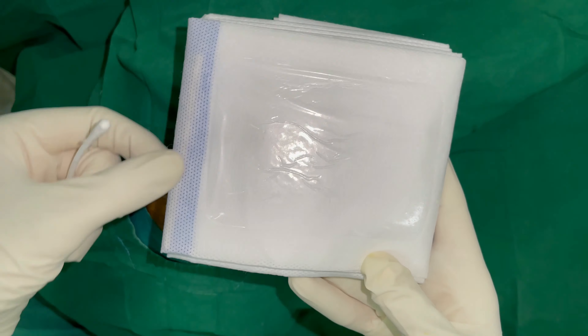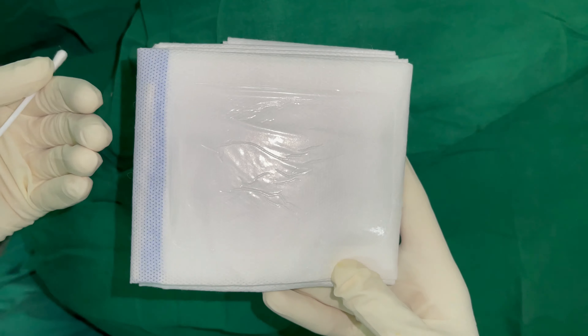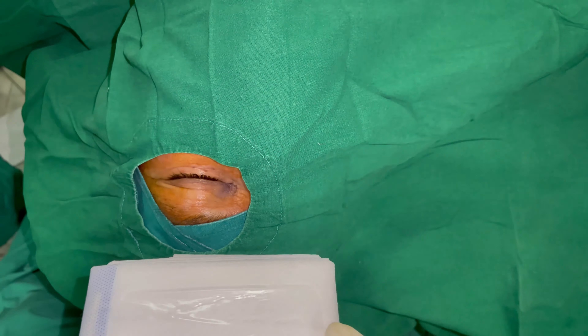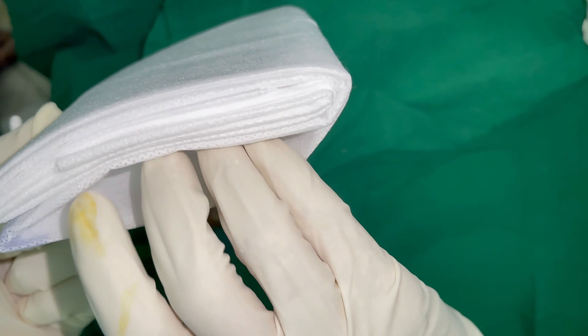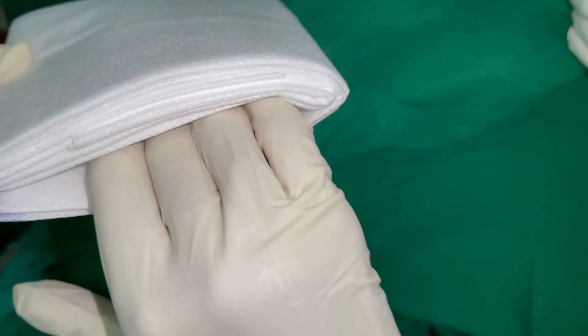The blue area with the metal clip houses the bag that holds on to the infusion fluid that comes out of the eye, and therefore this needs to always be temporally oriented. It is important for the person who is draping to slip their fingers into the lower part, as I find that helps give good adhesion of the drape to the eye.